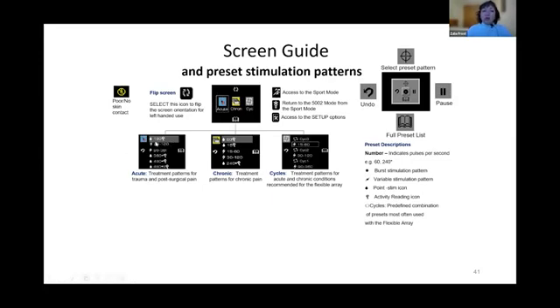So for example, here you have 180 pulses per second, and you can see a magnifying glass next to it. It means you can measure skin impedance when you use the device in this program. But the second program has an oscillation between 30 and 120.